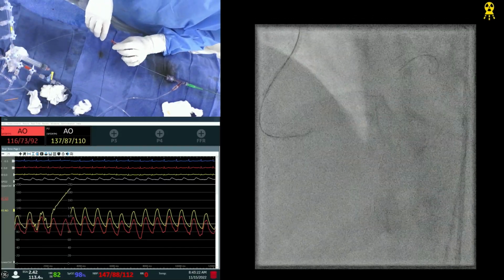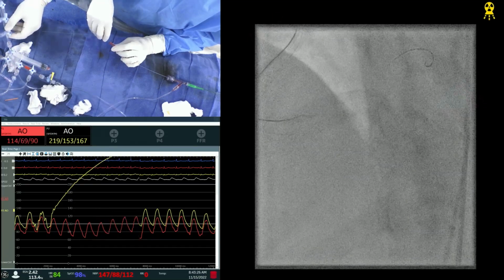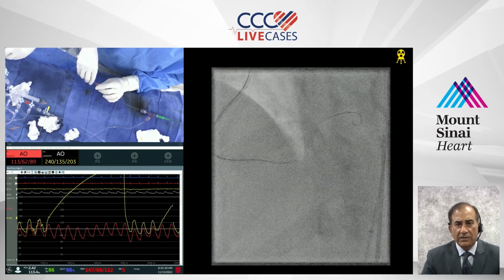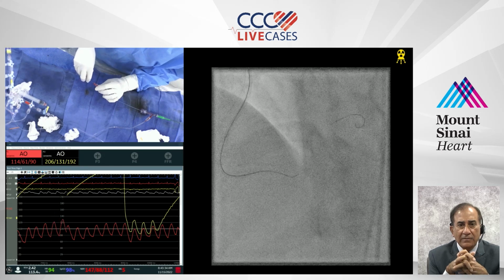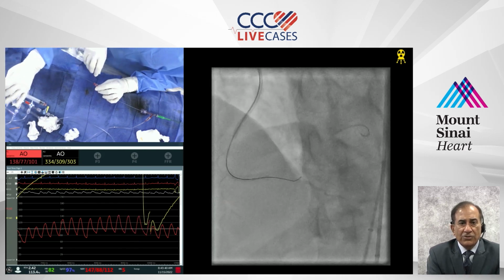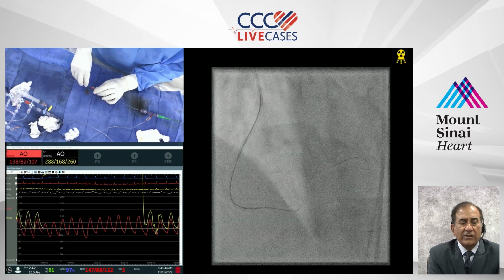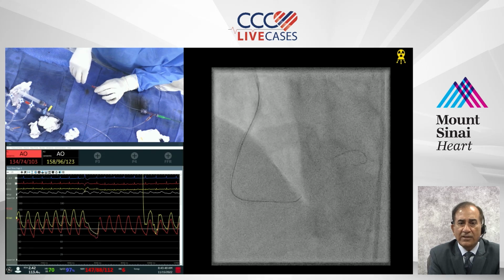Anu, I don't know if viewers have appreciated this. It's something I've noticed often about you in particular. And strangely, till today, I didn't even emphasize that. As you're working, your mind is constantly thinking ahead. Here you are using the Miracle, and now you're already asking for the next wire.